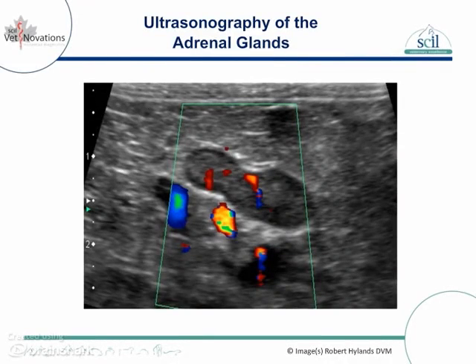Welcome to the Vetnovation's Ultrasonography of the Adrenal Glands online teaching module. In this presentation, we will review the anatomy of the adrenal glands and the relationship to other organs and vasculature in the canine and feline abdomen.